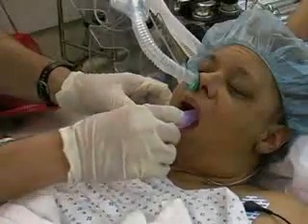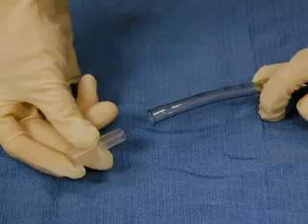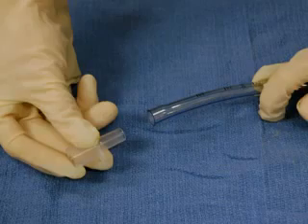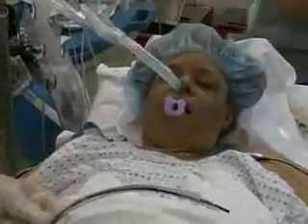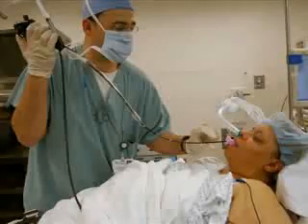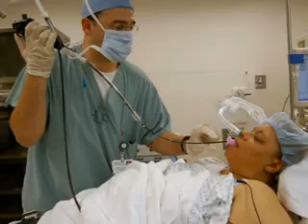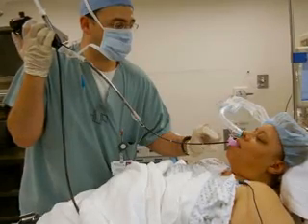Insert a number 10 Williams intubating oral airway into the patient's mouth. Remove the endotracheal tube connector from the tube. Thread the endotracheal tube over the fiber optic scope. Loosely tape the tube to the scope. Hold the fiber optic handle in your dominant hand and direct the flexible probe with the opposite hand.